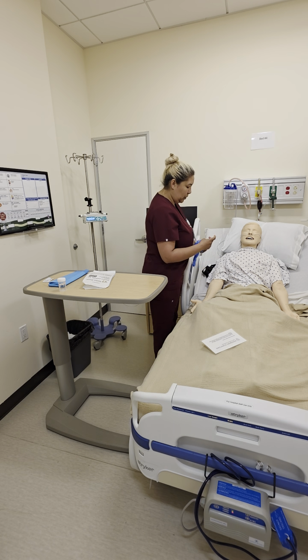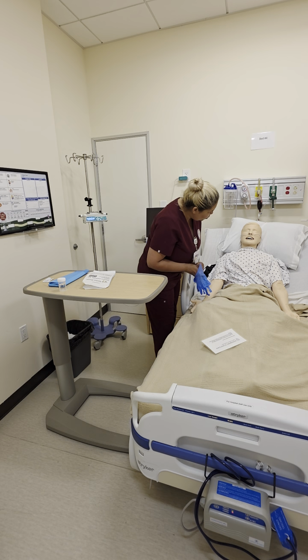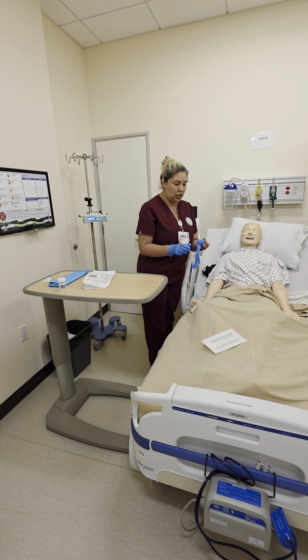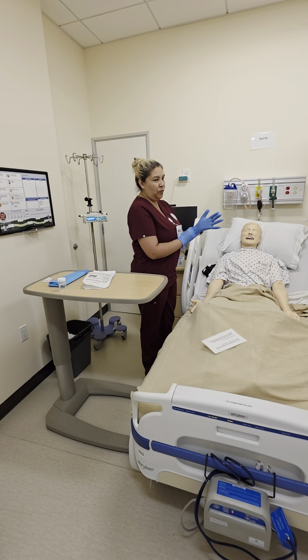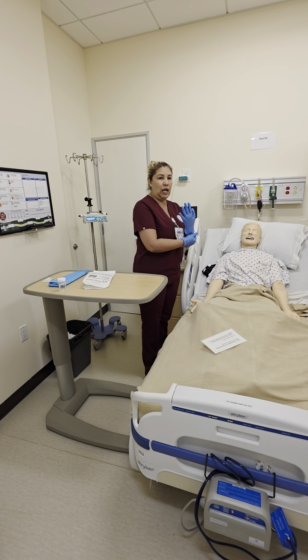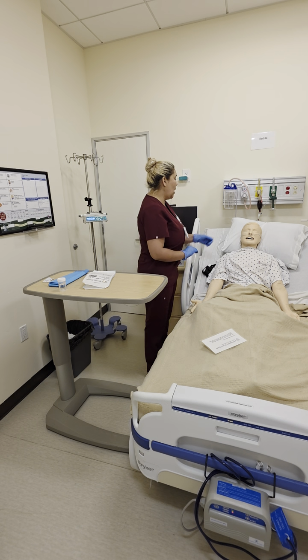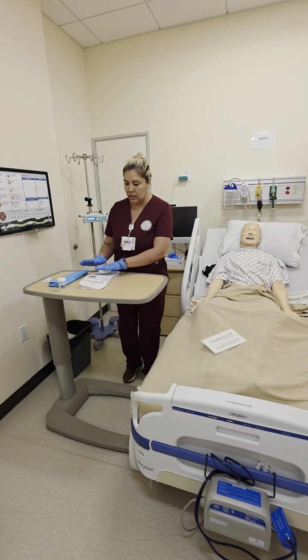While I'm doing this, I'm also going to be evaluating his face, making sure that there is no trauma in the nose or in the face. Contraindications for this procedure would be low platelets, any coagulation disorder, any face trauma, or any injuries to the nares. So I'm going to be evaluating. Nope, everything looks good.